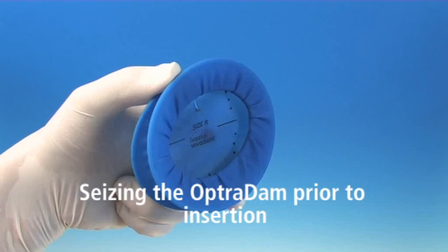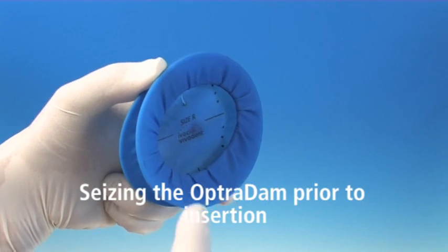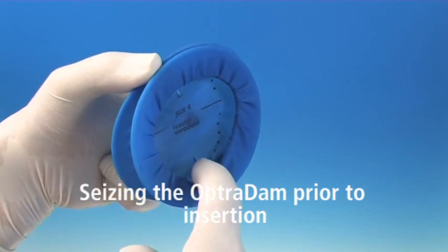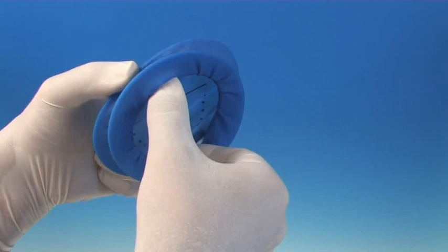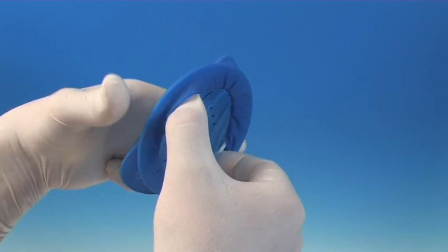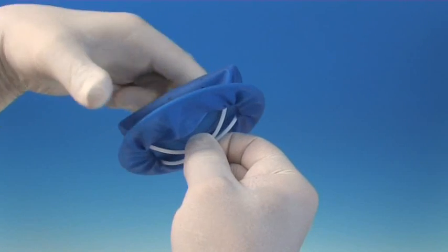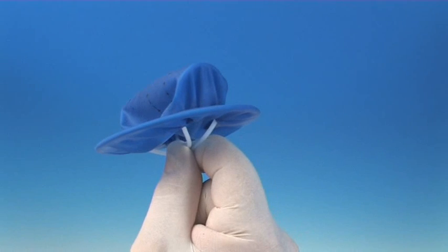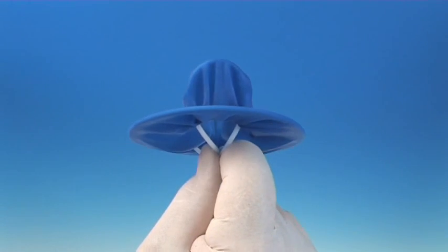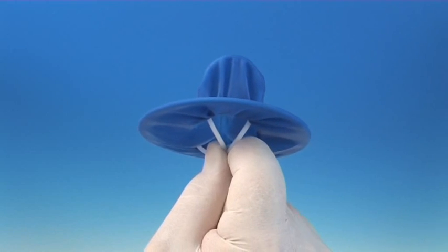Hold the Optredam in your left hand with the opening towards the right side. Grip the intraoral ring with the fingertips of the right hand directly through the opening and compress it completely. It is important to completely compress the intraoral ring until it touches itself and until two wings spread sideways at the closed side.